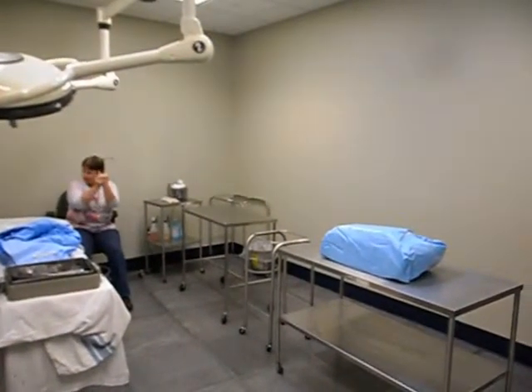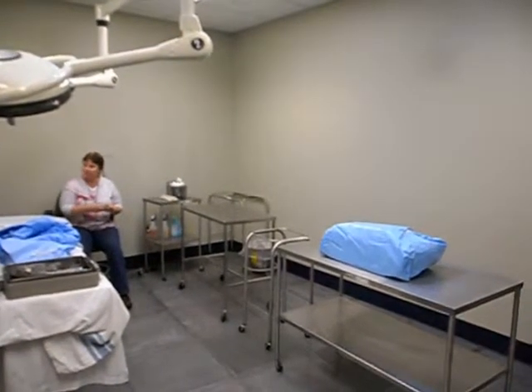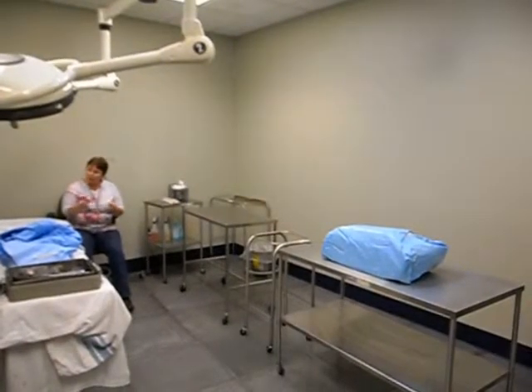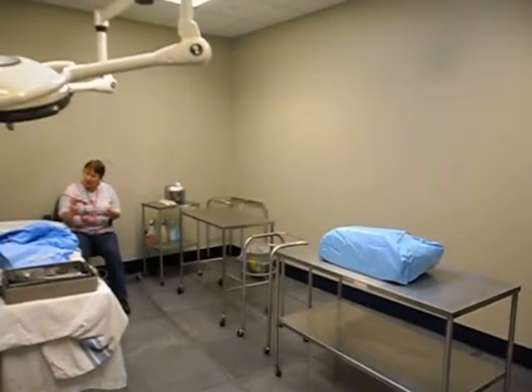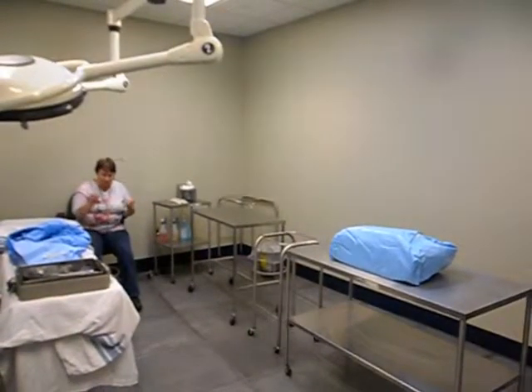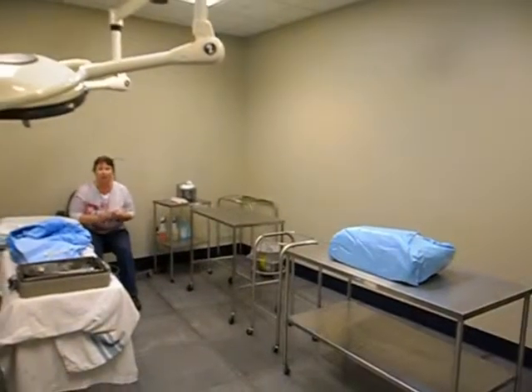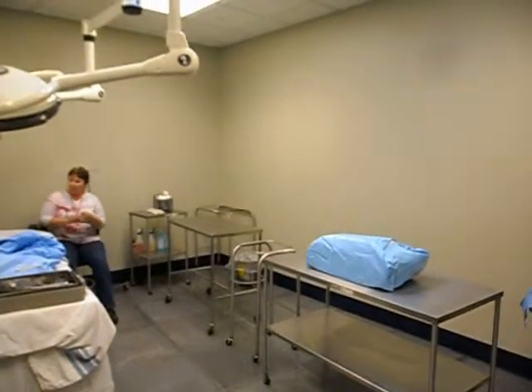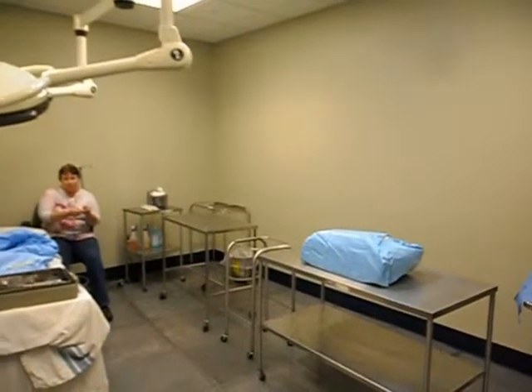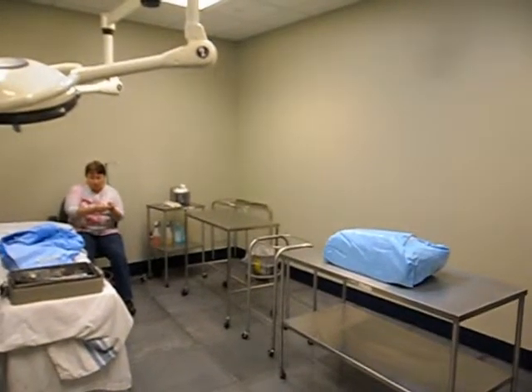So that's one stitch we need. And what size do we usually use on the skin? Probably like a 3/0. And that's physician preference, what kind? Okay, what kind of needle tip? Skin. What goes on skin? Cutting. Excellent. Cutting, right. So we need a cutting needle. Okay, we got skin. Then we got sub-Q we gotta close. So we need a stitch for sub-Q.